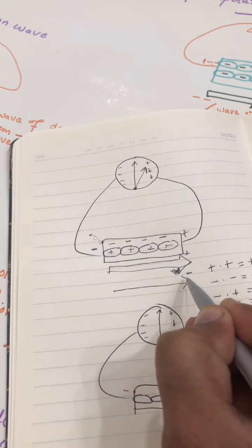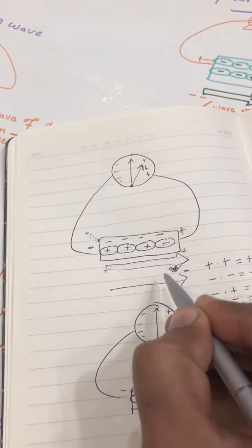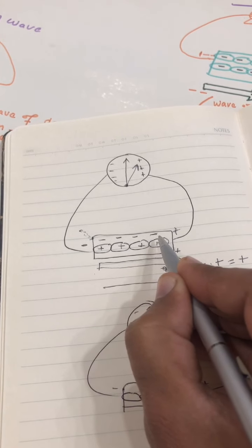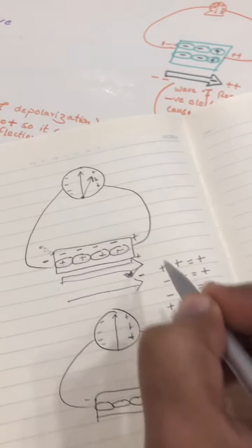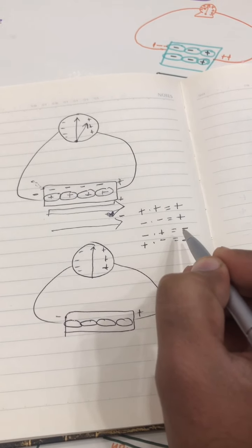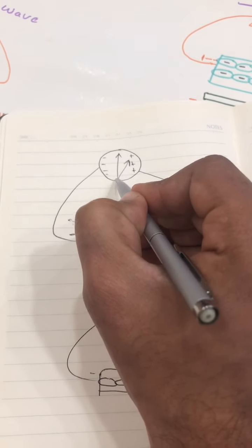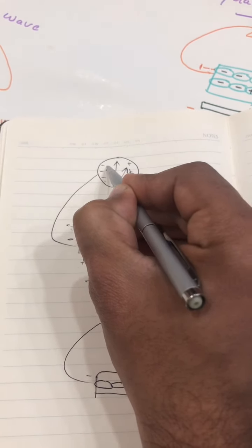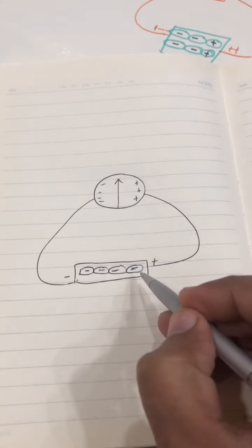So we're gonna put negative charge over its head. Now let's see that wave of repolarization, that is negative, is going toward this positive electrode, and here we have studied that negative and positive gives you the negative result. So this deflection is going to be negative. The deflection of this needle will come toward the negative side.